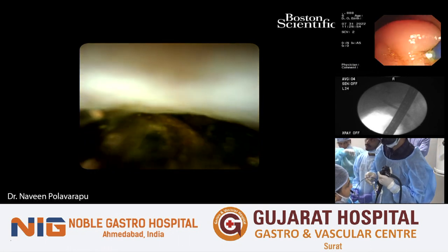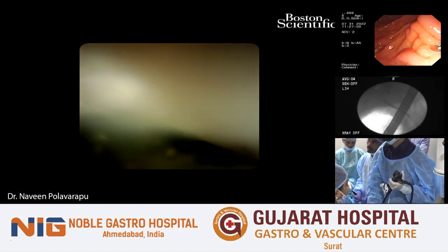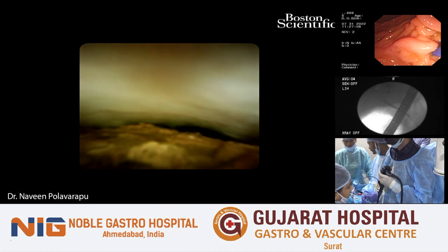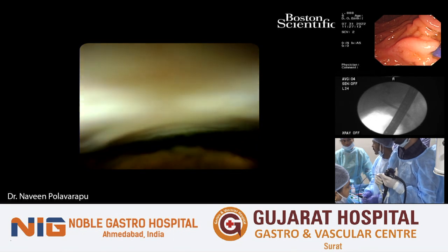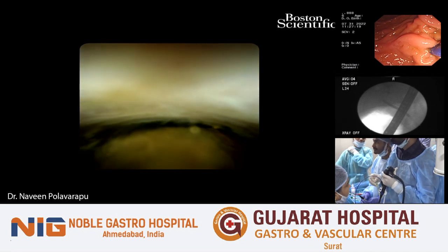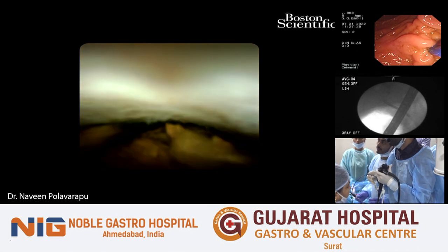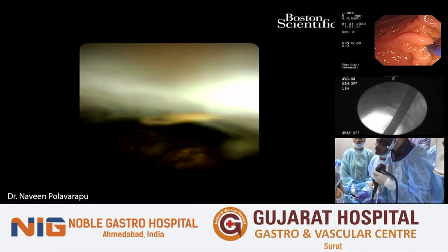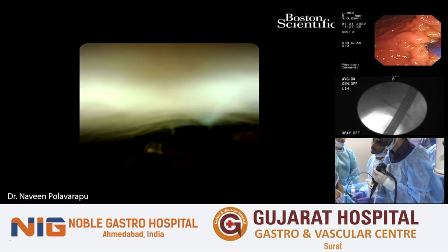I think it already made pieces. And one of the pieces, I'm trying to break it even further. You can see the 2 pieces already there. Just pulling back the scope a little bit to get a better view. I think it already broke into pieces, to be honest. It's already broken into pieces, I think. Yeah, it's done, I think. Yep. You can just retrieve the stone, right?